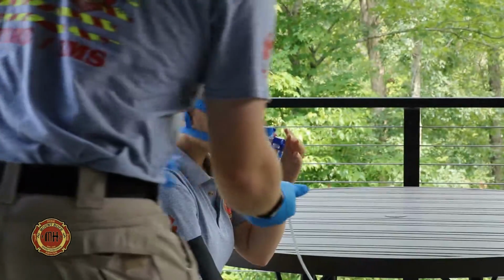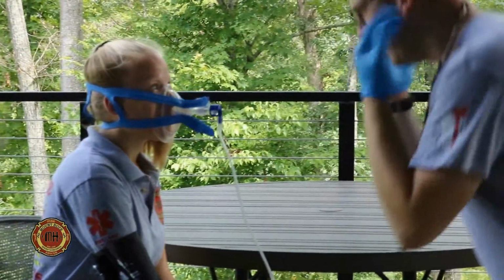So you take your hand in. Do you have any leaks around the edges?